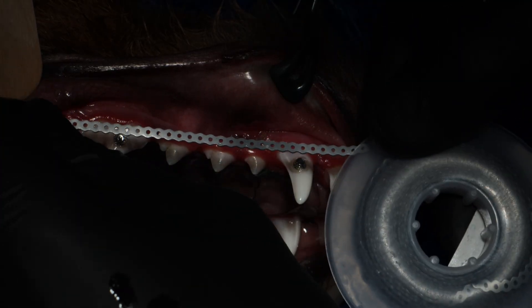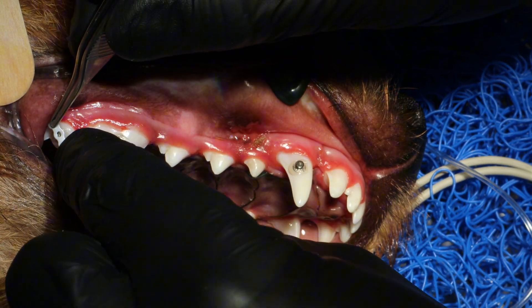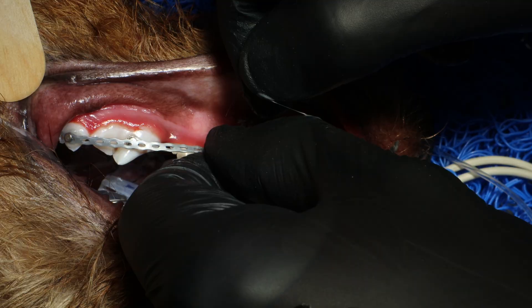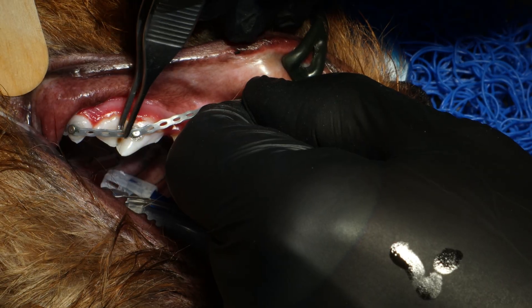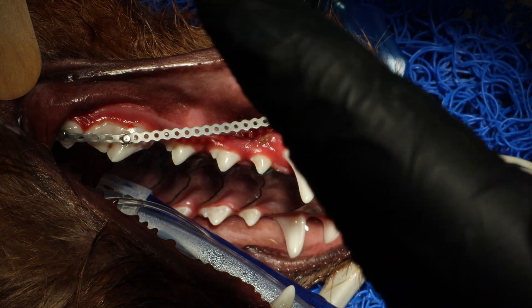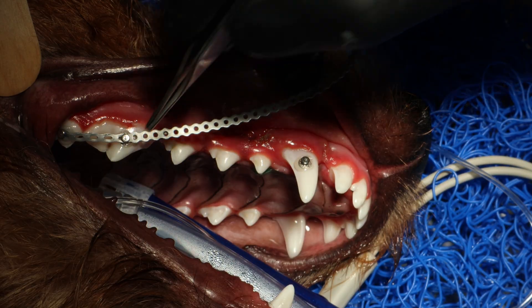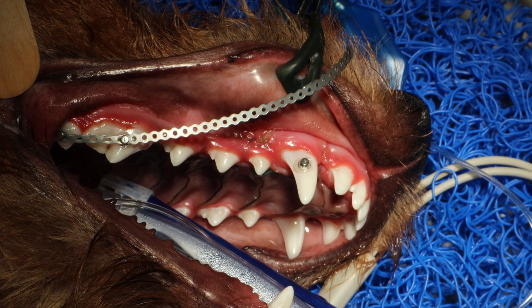Now we are ready to apply the power chain. It's a flexible plastic band and they come in all shapes and sizes. I recommend getting the one with the most holes where the spaces between holes are the smallest, because that will make it easier to adjust correctly in small breeds. You want to place it quite tightly between these two teeth, so by tightening the elastic band a lot you will push the teeth together and they will serve as a powerful anchor so that it's the canine tooth that moves and not 108 or 109.